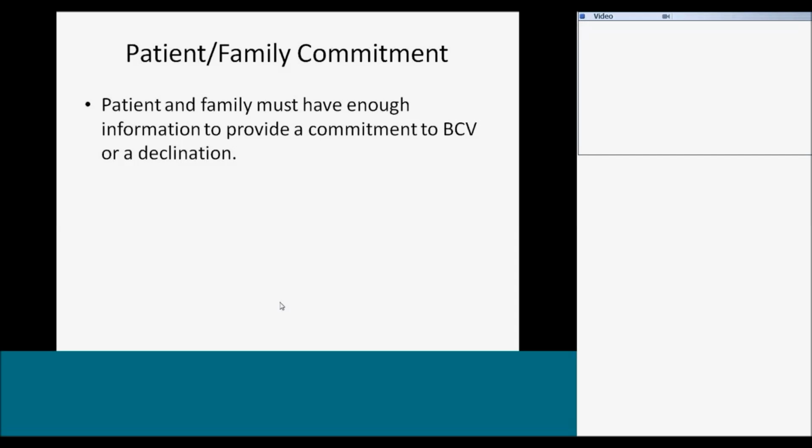Going into this process, you need to get some commitment from the patient and family. So you want to give them enough information for them to be able to tell you, yes, I want to go forward from here, or save you a lot of trouble. If they're going to put the brakes on and refuse to go forward, it's better for them to do it early rather than after you spend an hour or two trying to get the settings adjusted perfectly for them, and then they decide that they don't want it.